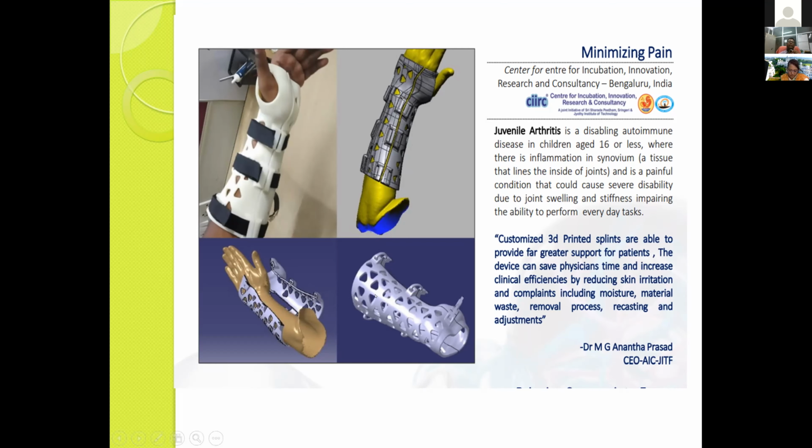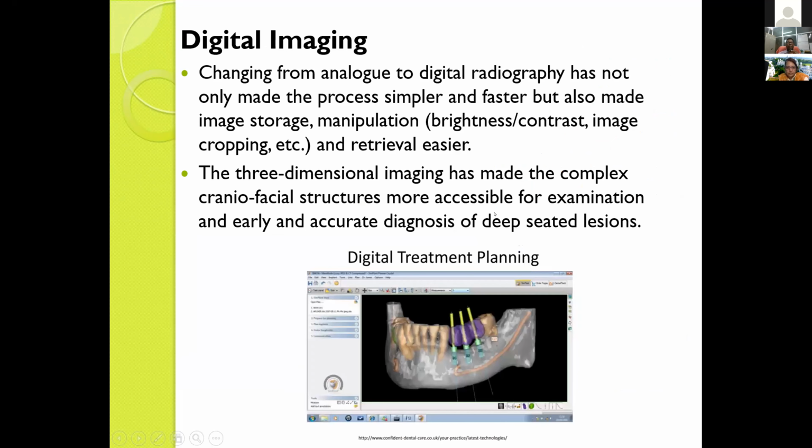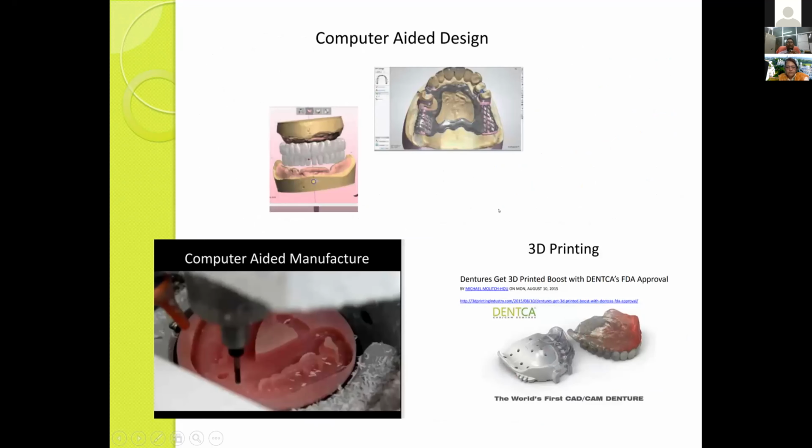So lab scanner, from the dental point of view, we are directly calling it by this name because we are scanning an already prepared physical model, made using POP, some plaster or some other material. Okay, so from that point of view, I am taking some similarity. Okay, so these are the other examples.